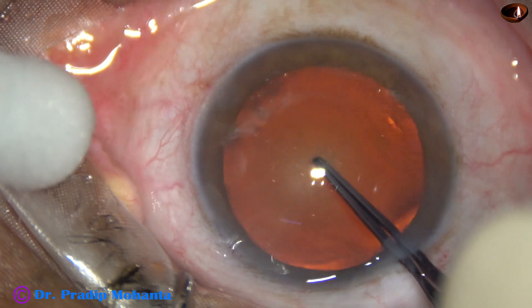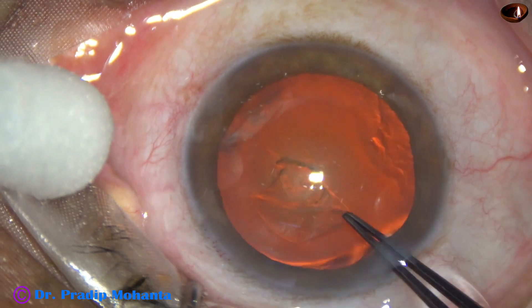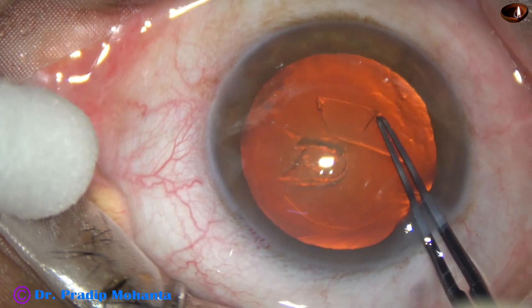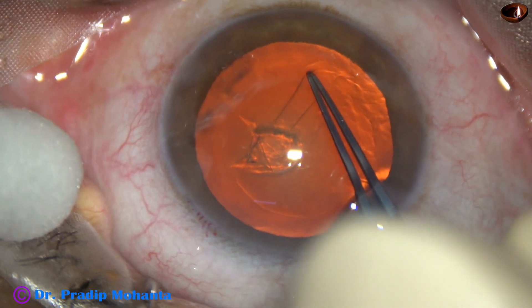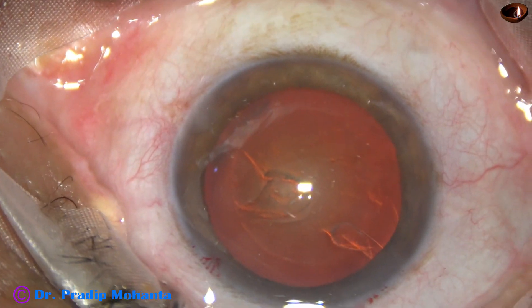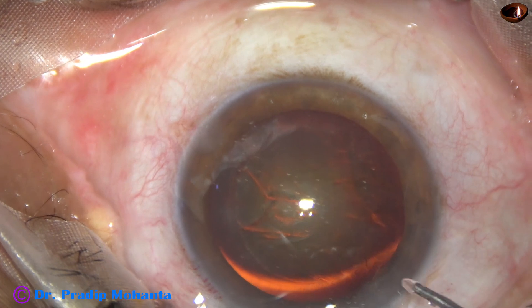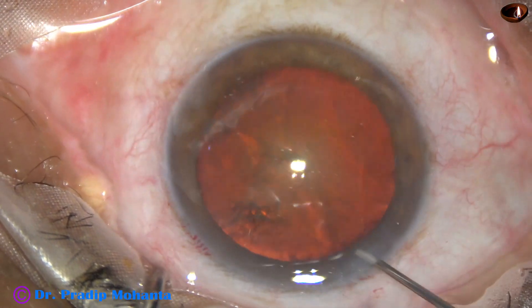Now capsulorhexis is being done with the help of Utrata forceps. I learned this technique from Dr. Nito Rosateli of Brazil. This is a nice way of doing capsulorhexis with Utrata forceps. We don't have to use a cystitome to make a flap of the anterior capsule except in some cases like weak zonules and hypermature morgagnian cataracts.